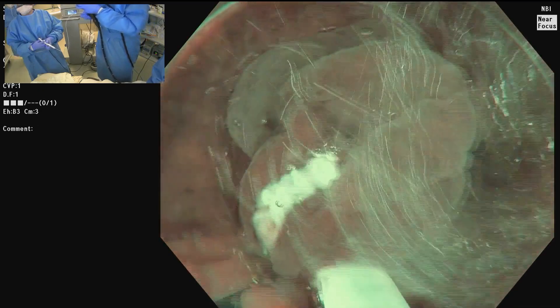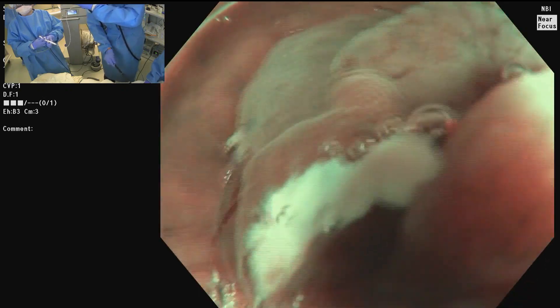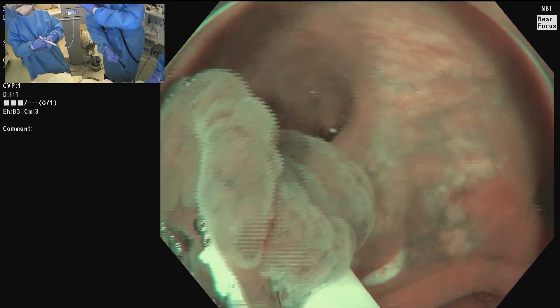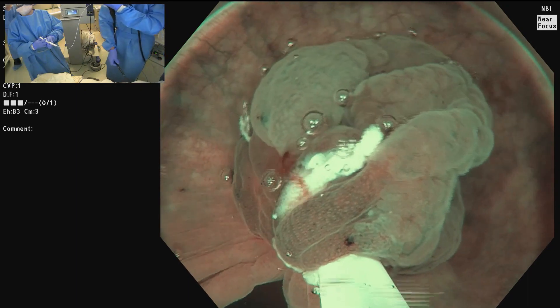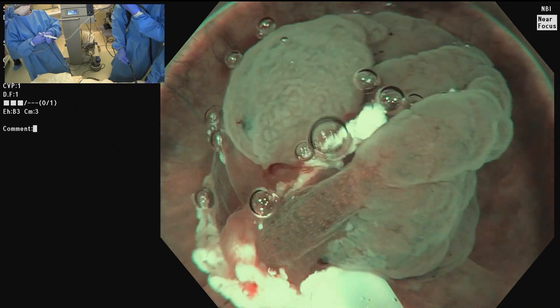I'm looking just to make sure I've got dots around — rotating like a rotisserie. That dot is a little bit on the outside, but it looks good. So now we're ready to take this off. I'm using pure water cut; my settings are Effect 5, ENDO CUT, 50 watts. And we're taking that off.